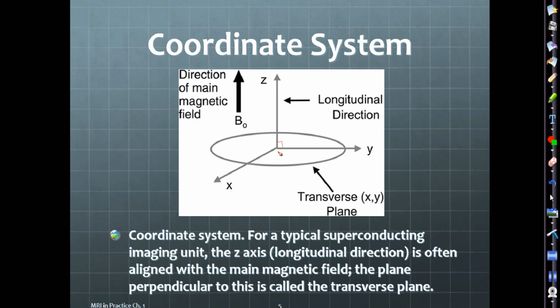And just think about our x-axis coming out towards us. It's hard to draw a 3-dimensional diagram in 2D, but imagine this one's coming out towards us, and then this one's shooting off to the left and to the right. Okay? Any questions about our coordinate system?